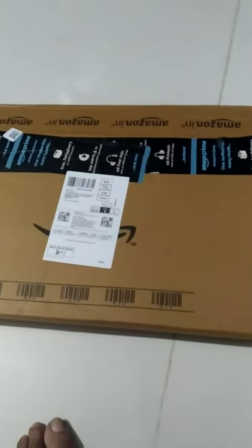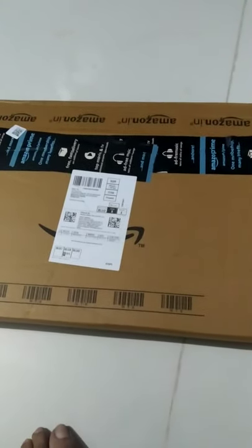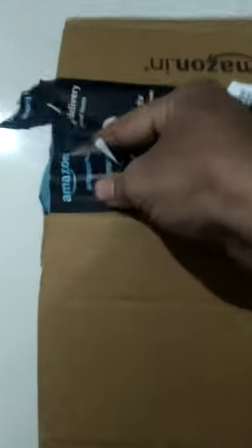Hi friends, today I'm going to show you the unboxing of a digital weight checking machine. I got it delivered from Amazon today. I'll unbox this particular product and show you — I bought it from Amazon and it cost around one thousand two hundred.